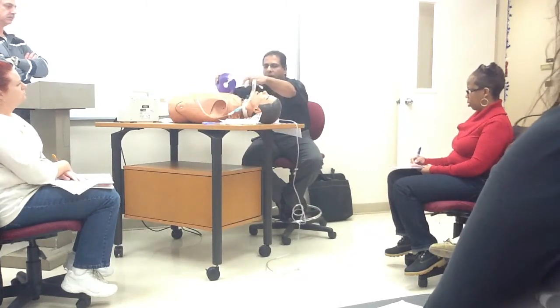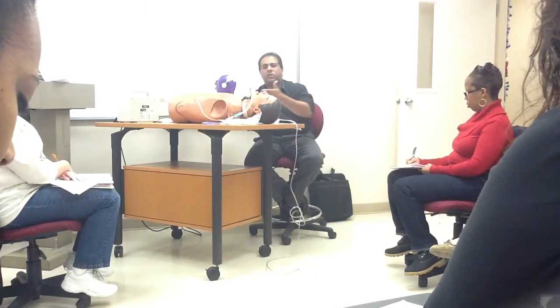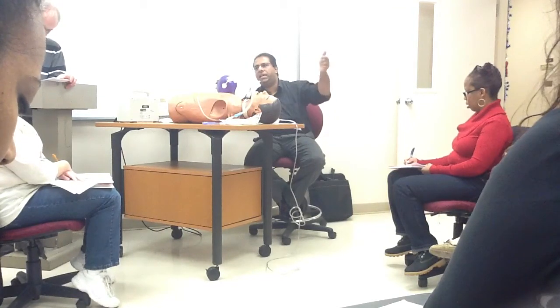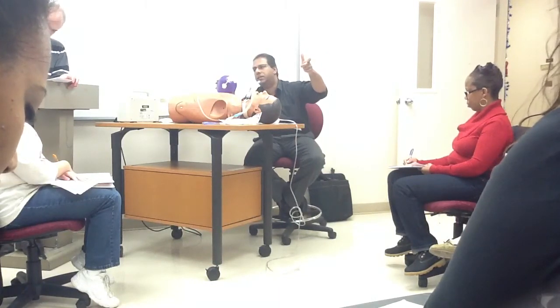Hyperoxygenate that way, for about a minute or so, 1 to 2 minutes. And if the patient is not on a ventilator, if they're on a trach collar, how do you hyperoxygenate? Well, a couple of things you can do. You can hyperoxygenate by taking the patient's FiO2 from whatever, like if they're on 40, take it up to 100%.